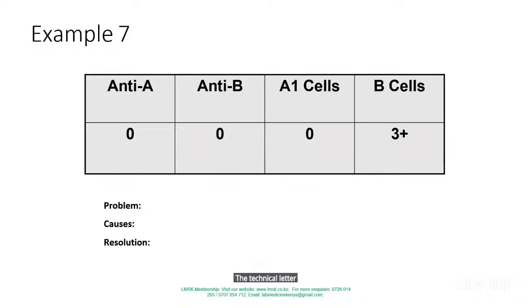You really have to check whether the labeling was correct, whether you put the cells, especially the A1 cells. So this is mostly a pre-analytical error. So you have to definitely rule it out.